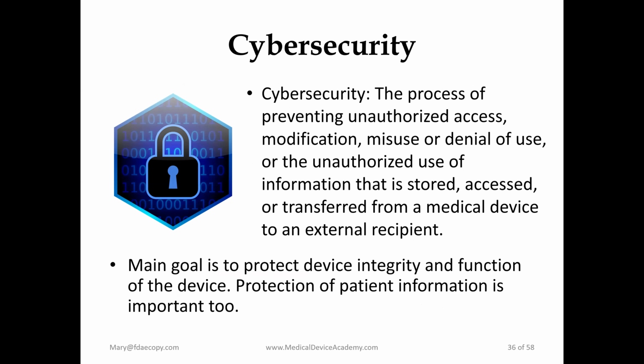So cybersecurity is the process of preventing unauthorized access, modification, misuse, or denial of use, or unauthorized use of information that is stored, accessed, or transferred from a medical device to an external recipient. The main goal is to protect device integrity and function of the device, and protection of patient information is also important. Obviously there have been some cybersecurity threats recently, and there are cybersecurity vulnerabilities, which could be really dangerous in the context of medical devices.